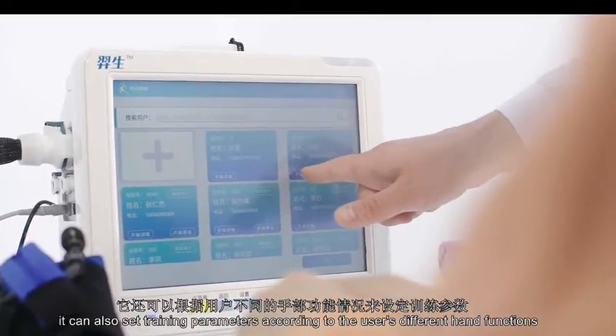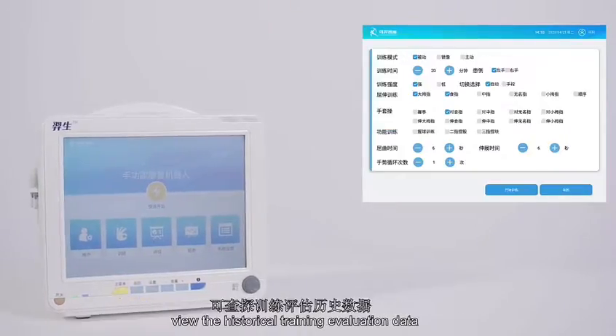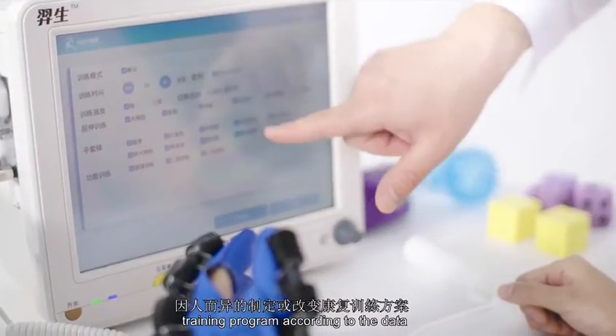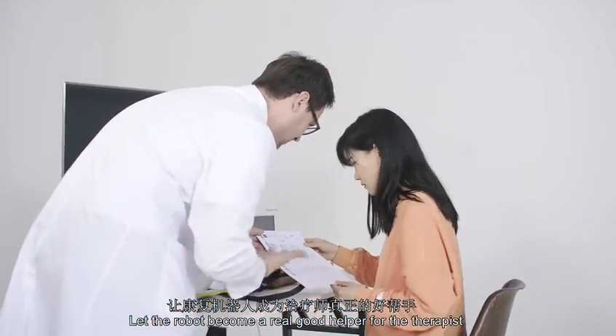It can also set training parameters according to the user's different hand functions, view historical training evaluation data, and formulate or adjust the rehabilitation training program accordingly — letting the robot become a real good helper for the therapist.